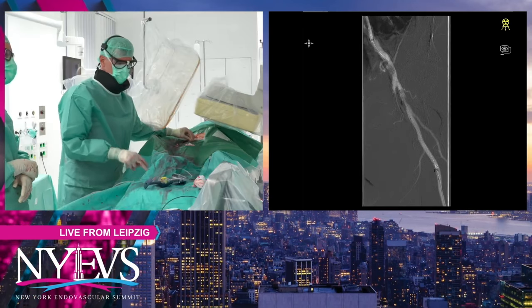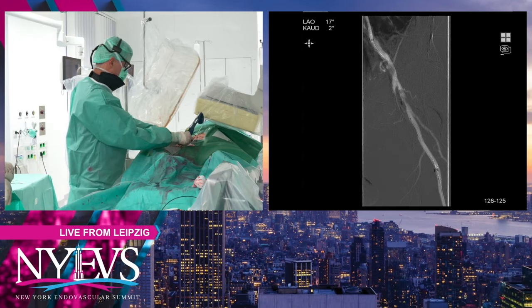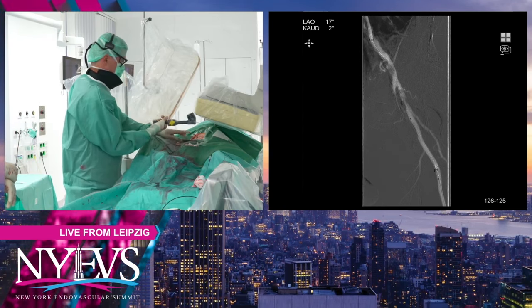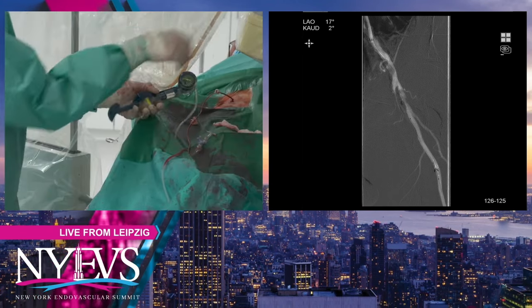Would most here just continue on and finish the intervention at this point, even though there's significant debris in the filter, and just deal with that at the very end of the case? Since it's the Profunda right now, it's not going down the leg at this point.